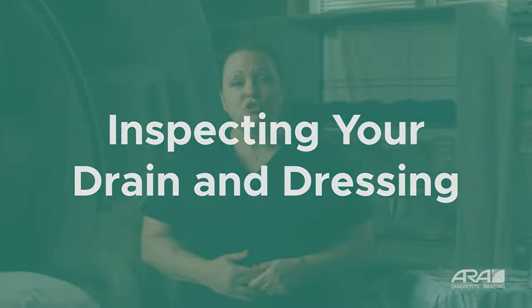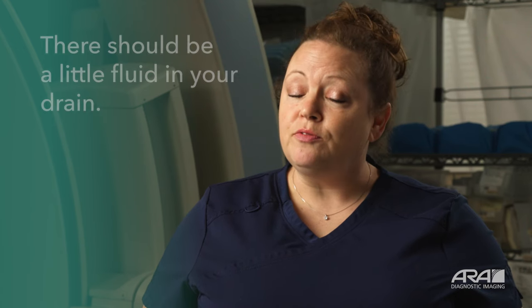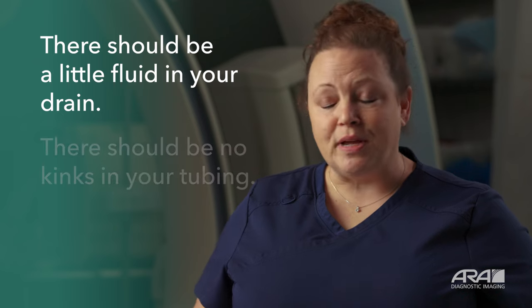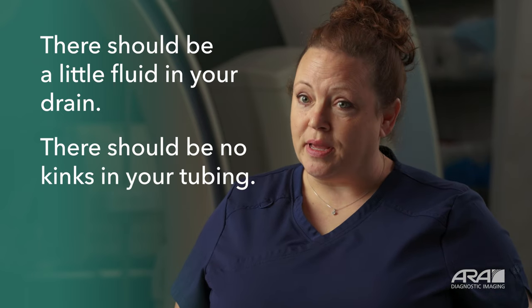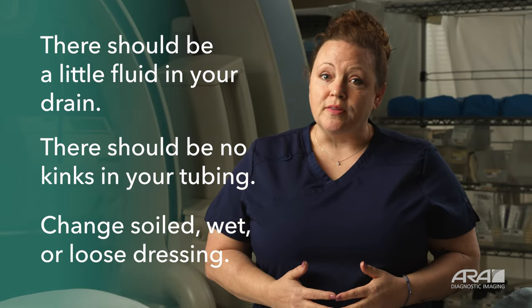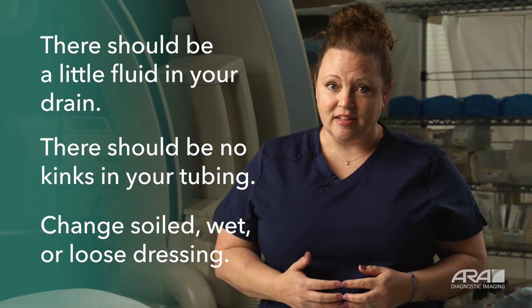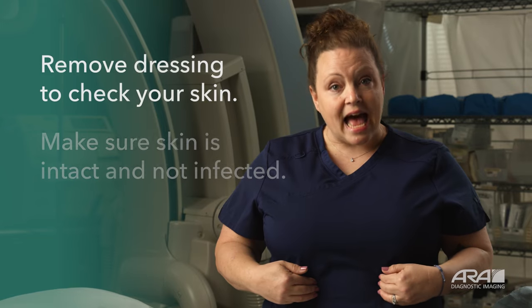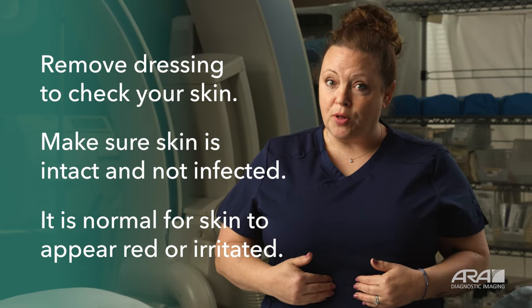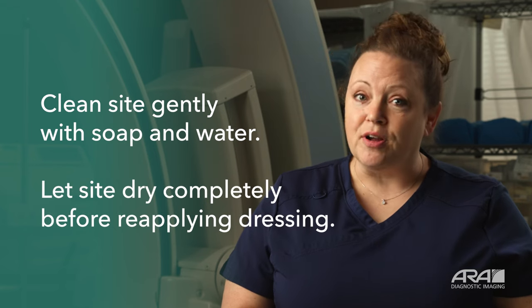Every day you're going to inspect your drainage system. Find a handheld mirror or a long mirror and use that to look at your drain. There should be a little fluid in your drain and it should be free flowing — no kinks and no bends in the tubing between the drain and the bulb or bag. Inspect your dressing. If your dressing is soiled, wet, or appears to be loose, change that dressing. When you remove your dressing, take a second and look at the skin underneath. Make sure your skin is intact. It's normal for it to appear a little abnormal. You may need to clean that site, and let it dry completely before you re-cover and bandage the site.